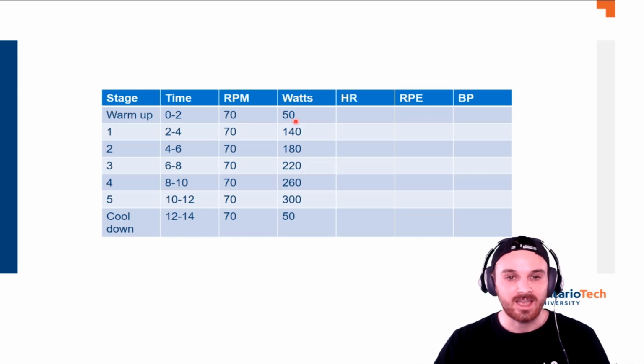I typically have a 2-minute warm-up at something around 50 watts just to make sure the participant is comfortable but not tire them out. And typically you could see overall better endurance performance if you warm the person up a little bit better.